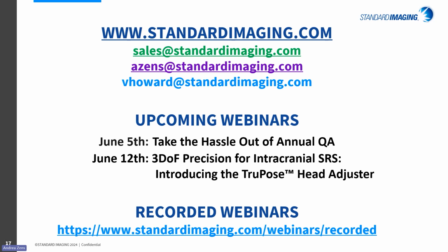Is it a good plan? Does it match? Is there a good independent check of that, which IMSure 3D offers, paired with the excellence and high resolution machine QA? Aren't those things really, at the end of the day, giving you more data for a system that is automatically repositioning all the time? It's a question I hear. I'm not a physicist. I don't have the answer, but I am aware of that in TG135B as well.